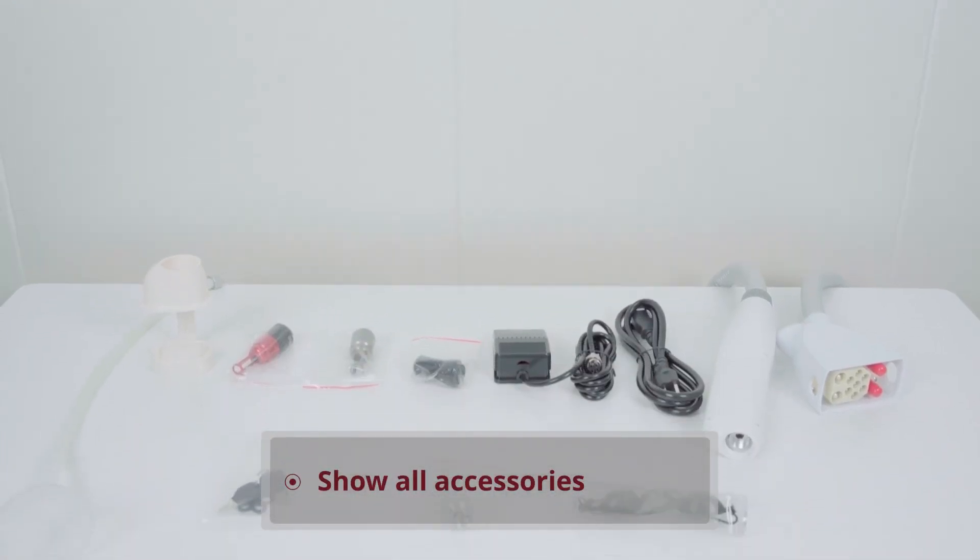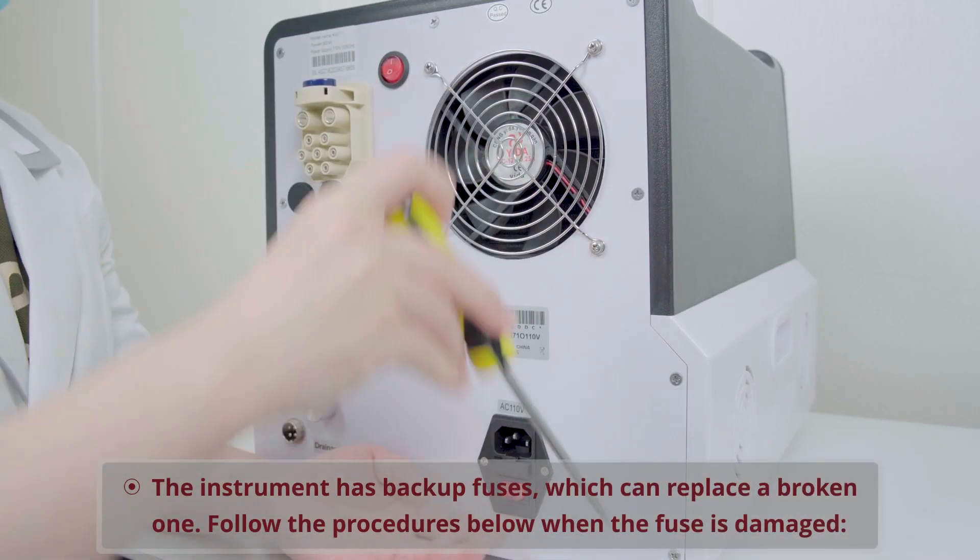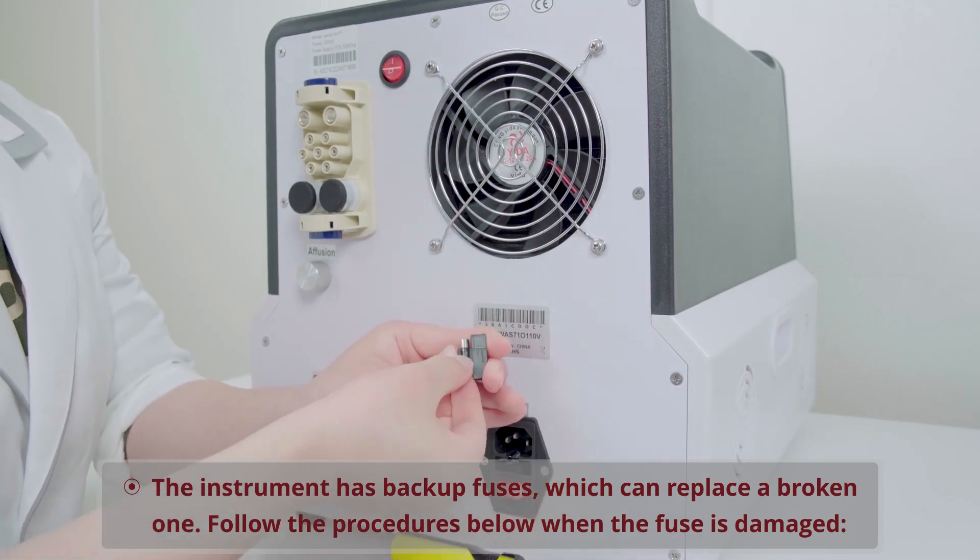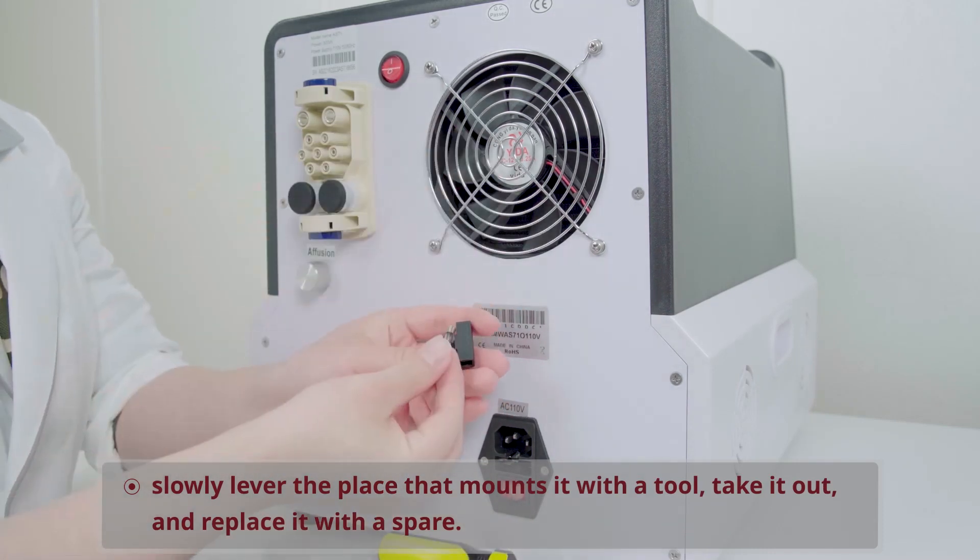Show all accessories. Show the main machine. The instrument has backup fuses which can replace a broken one. Follow the procedures below when the fuse is damaged: slowly lever the place that mounts it with a tool, take it out, and replace it with a spare.